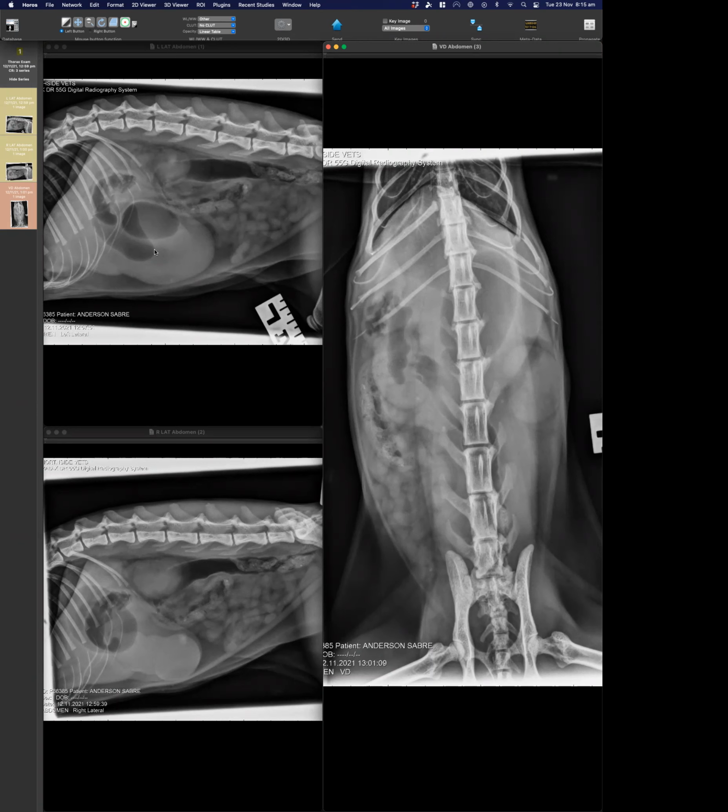I'm concerned about your comments. I can't think of any other organ that could be that distended. But I'm wondering if this is... I can play a game and say, why is that not a splenic mass? Because it looks fluid filled and there's gas in there. Okay, good. So that's the argument that I was after. And that's the reason.